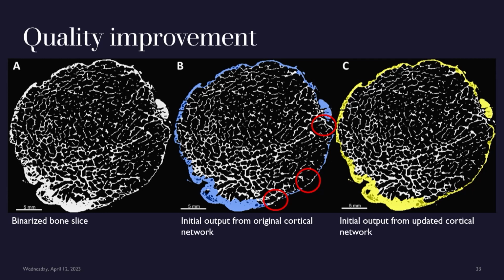One of the things with the plugins that we had developed, and some of them, I will say, were pulling some code from legacy stuff, is that we did have one ROI that was just cortical bone, and we had a second ROI that was cortical bone and any cortical porosity. Because especially with aging, we know we have some of those areas that have the big pores. The way that we did some of the ROIs, once we had the cortical and the bone, it was just a bunch of Boolean operations to get here's the trabecular bone, marrow space. We filled those in so that when you went to take the whole bone volume and subtract out the cortical, you didn't have weird pockets identifying as trabecular bone that were clearly within the cortical bone. So I think this one is probably just the cortical all, which would be the cortical bone plus the cortical pores.